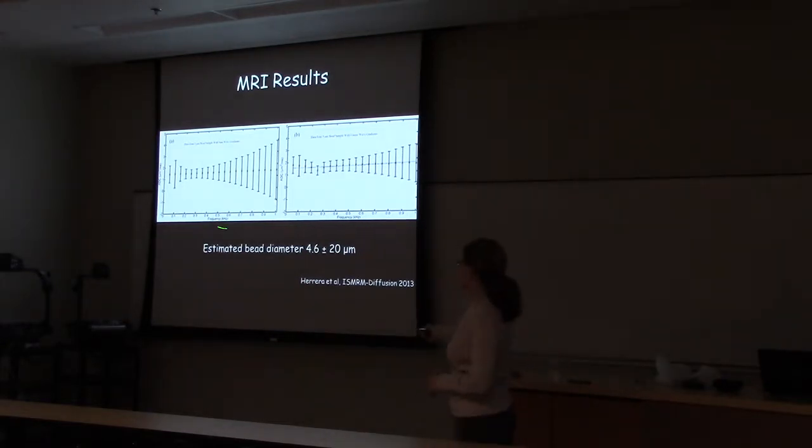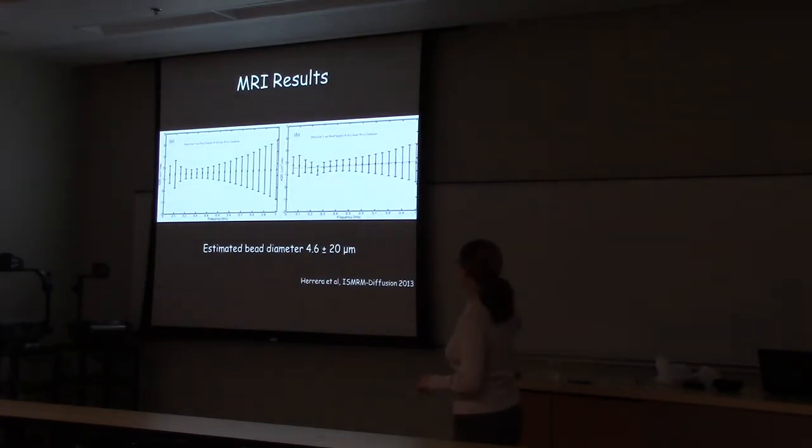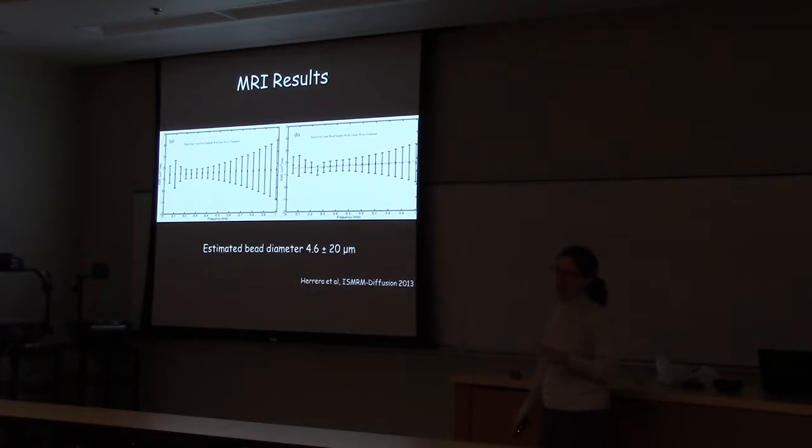So it's actually much harder to figure out from here, although much easier to run a sine wave because the sine starts at 0 and ends at 0. A cosine starts at 1 and ends at 1. So I think in the simulation, this is a perfect cosine. In the gradient waveform, it's called an apodized cosine.